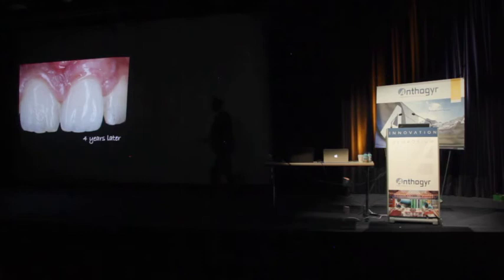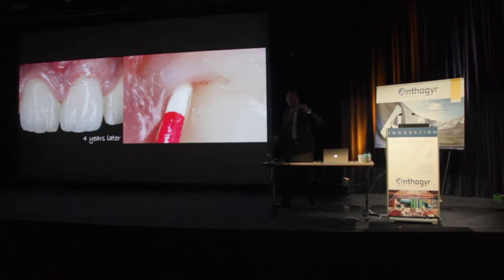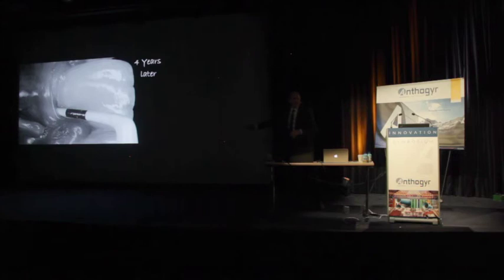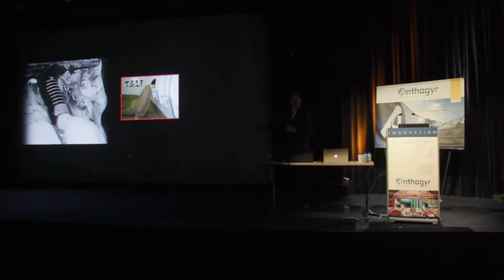And I see in this particular area, there was some liquid coming out of this interface. And this is not peri-implantitis. This is mechanical irritation. Why? Well, when I started probing, I started feeling some rough surfaces, and I went deeper and deeper and deeper. It became quiet in my treatment room. None of the assistants was talking anymore, because this is what I discovered. Not nice. I lost all the buccal bone, and this is how I felt. And I buy a new t-shirt.